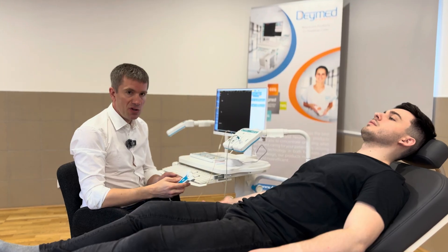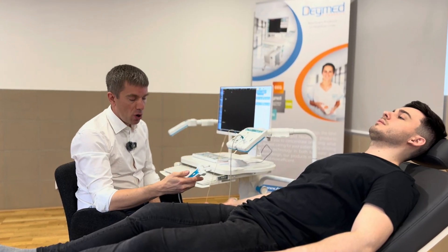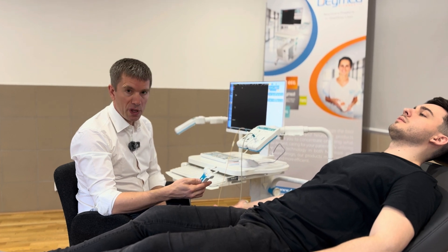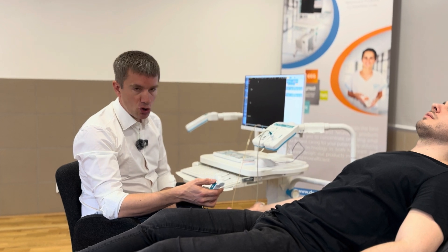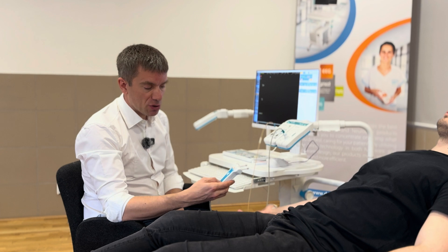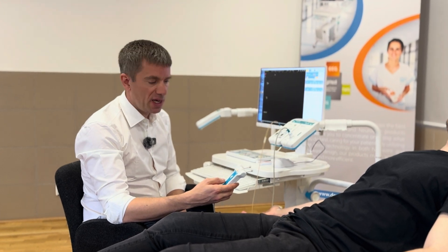I am using this electrical stimulator in my hand. On this electrical stimulator there is a button to stimulate but also a wheel to give a higher or lower intensity. The cathode should be pointing towards the recording electrode. By pushing on this I change the cathode and anode.